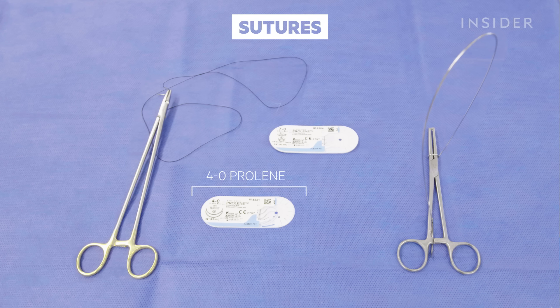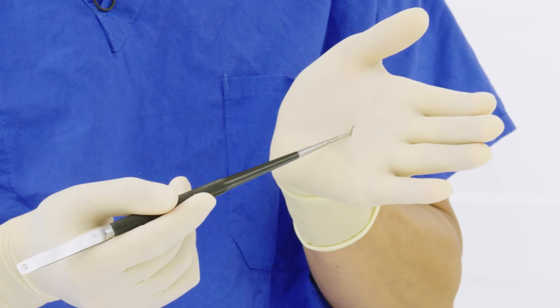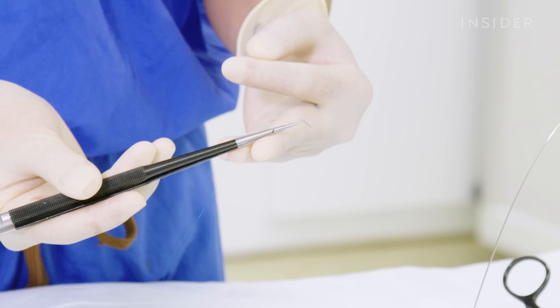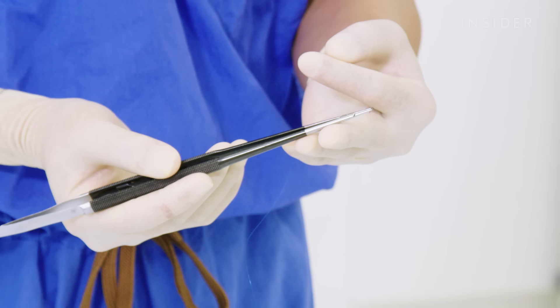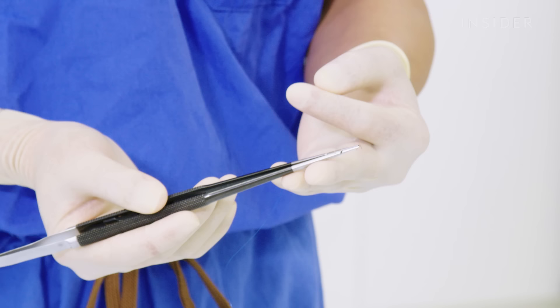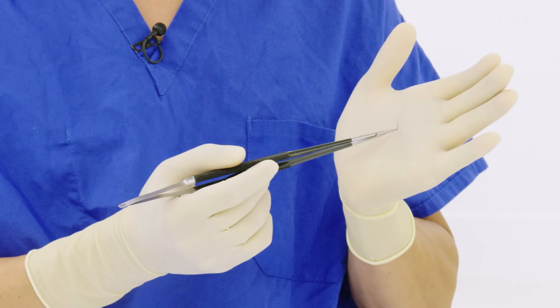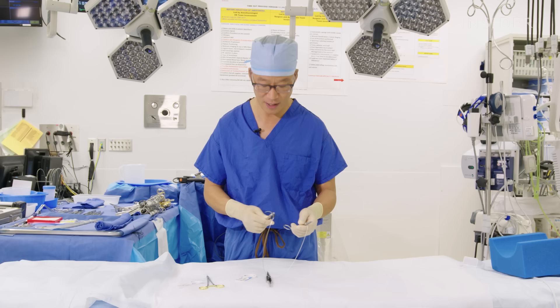Once it's time to sew the coronary arteries — the bypass onto the heart — this is 7-0 Prolene, and you can see how fine the needle is and how fine the suture is. The suture is as fine as a human hair, and this is why we need to wear magnification at the time of surgery. We're often using suture on blood vessels as small as two millimeters in diameter, which are very, very frail and paper thin. We want to be as careful as possible and make the smallest holes possible to minimize any sources of potential bleeding.